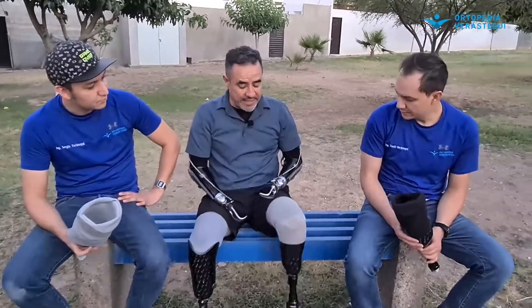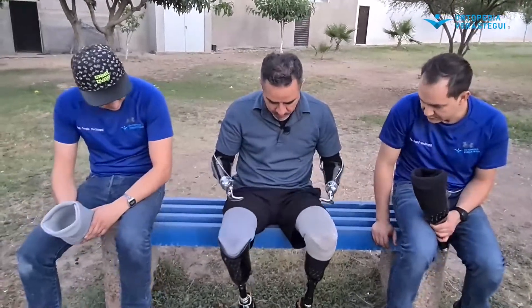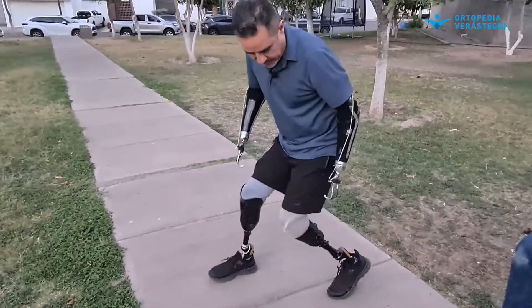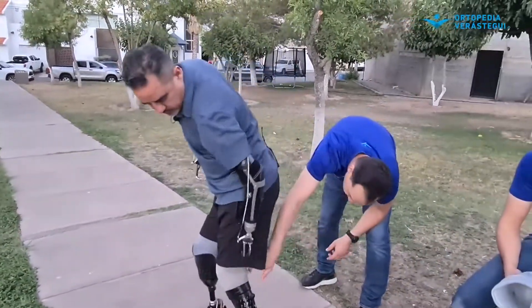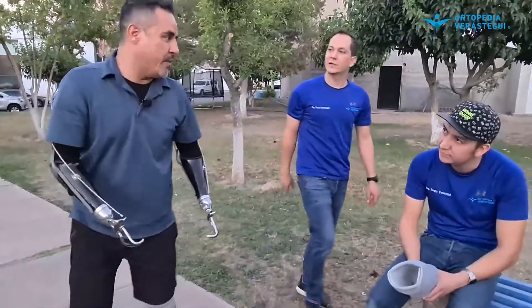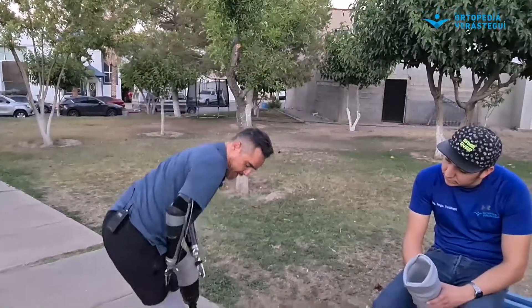Fíjate que en la doblada sí te da un ángulo mayor. Con el sistema convencional lo puedes doblar bastante, pero la bronca es que vas a perder el vacío, y aparte se hace como un churro ahí, incluso te puede llegar a pellizcar. Pierdes vacío y cuando te paras tienes que acomodarlo otra vez, bajar el muñón para que vaya ganando vacío otra vez.